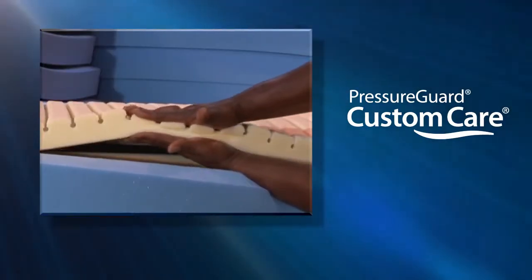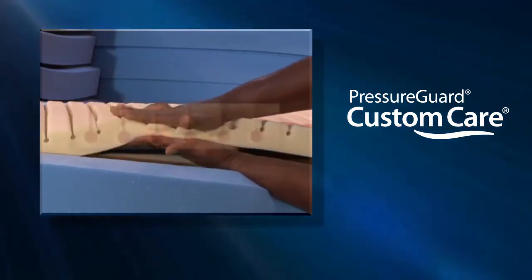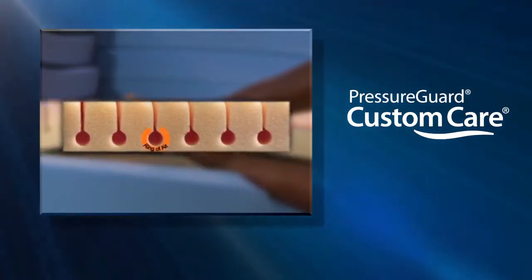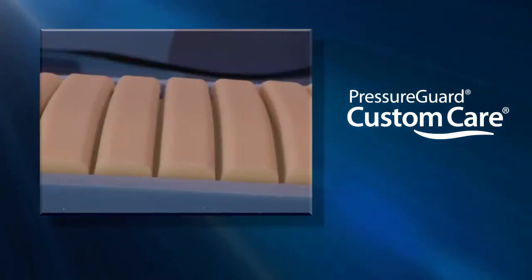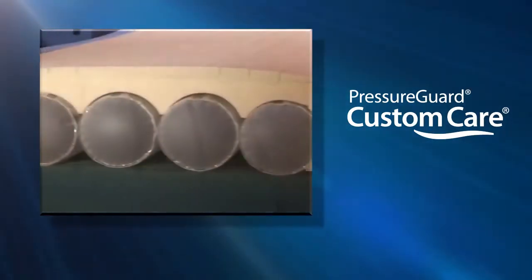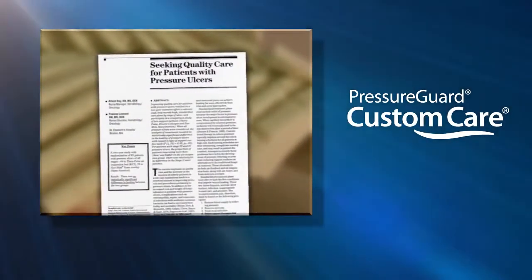The GeoMat top layer with more than 800 pressure redistributing support cells and exclusive ring of air is cut with SPAN's unique GeoMat segmentation, which reduces heat and moisture buildup on the skin and has been clinically proven to reduce the risk of pressure ulcers.